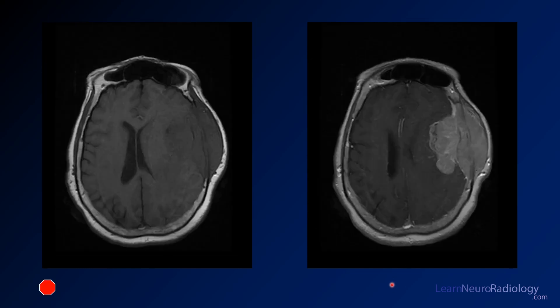The pre and post contrast images are quite helpful. On pre contrast it's fairly hypointense, probably similar to or slightly lower than muscle. On post contrast it's avidly enhancing — you see enhancement of the bone itself and nodular mass within the cranial vault as well as outside the calvarium.